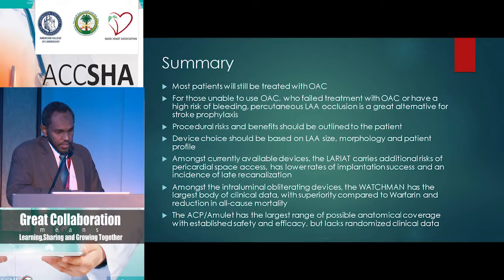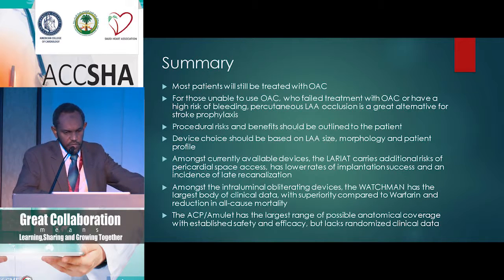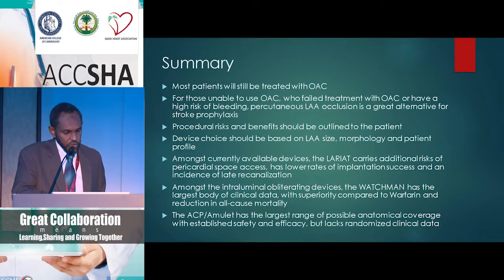Finally, I want to summarize by saying that most patients will still be treated with oral anticoagulants. For those who are unable to use oral anticoagulants, or who fail treatment with oral anticoagulants, or who have a high risk of bleeding, percutaneous LA occlusion basically gives you a great alternative for stroke prophylaxis. Procedure risks and benefits should be outlined to the patient, and device choice should be based on left atrial anatomy and size. Amongst the currently available devices, I think the LARIAT really should be avoided at this point in time because of the complications we mentioned earlier.